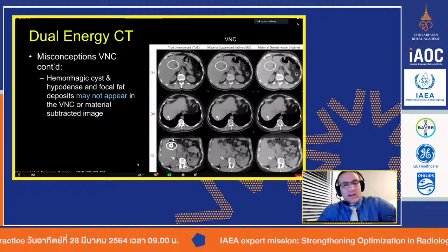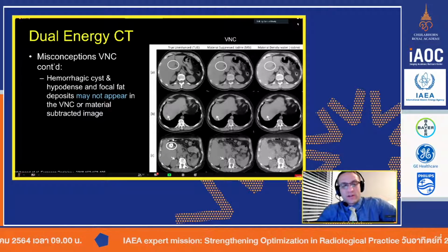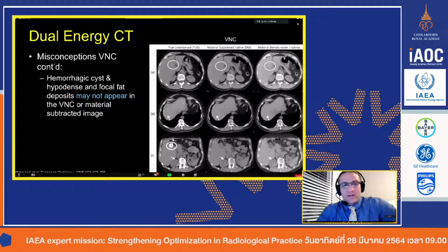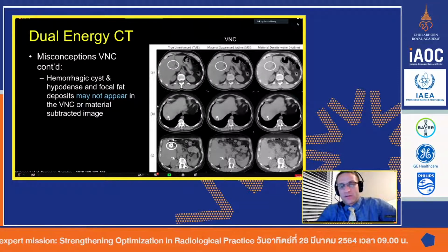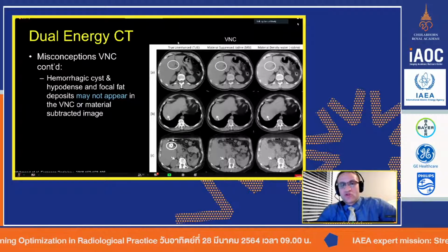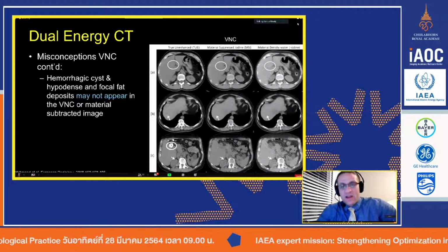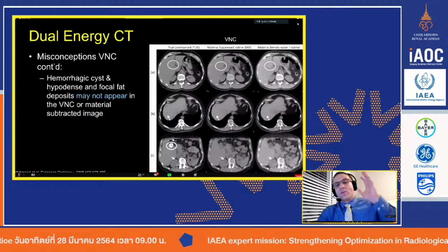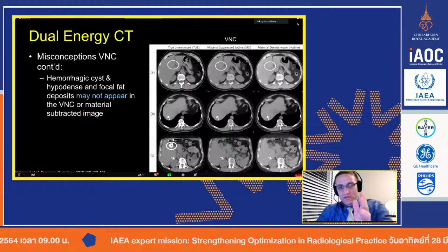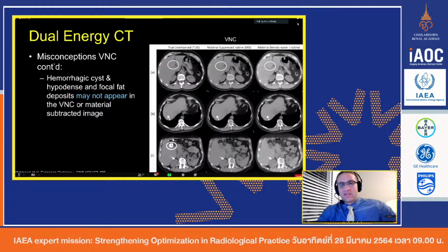Looking a little bit further into that, a publication by Mahmoud that came out in 2018 looked at, I can't remember, a hundred or more, a couple hundred patients. What they did is they looked at the true unenhanced images. So this first column, these are patients that were imaged without any IV contrast on board, what would be considered a true unenhanced image.